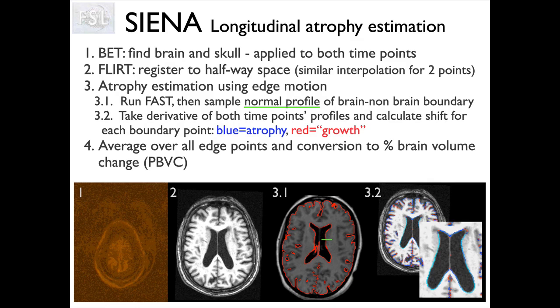And so what you might think is a 1mm voxel that you've asked for might be a 1.01mm voxel, which might not sound that drastic. A 1% change in 1mm is 10 microns. Do I really care? Well, actually you do, because that represents a 1% change in the linear dimension of that voxel, or a 3% change in its volume. And actually the kind of changes that we're looking at measuring in these brain images are typically 0.5% or something like that. They're around the sort of 1% level, sometimes going down even less than that.